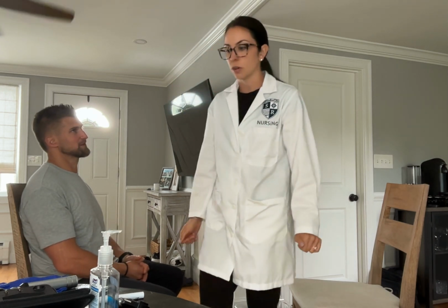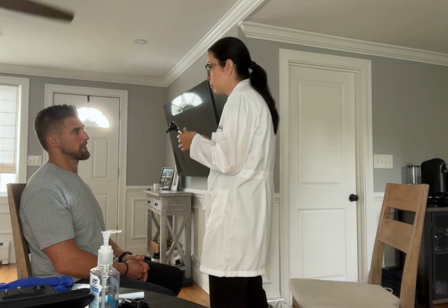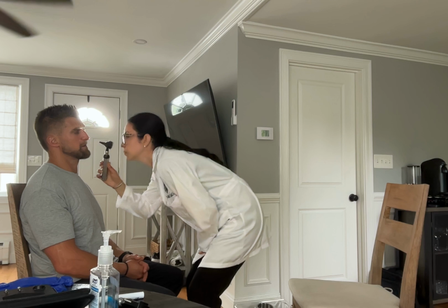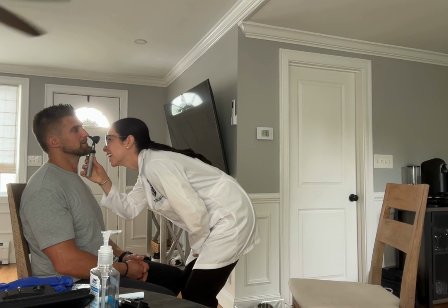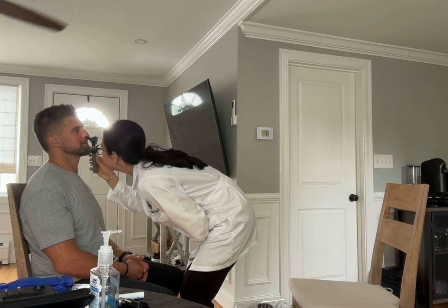Okay, then I'm going to use an otoscope and look in his nose. So I'm going to be looking for the mucosa, the septum, the turbinates. Check for any polyps or discharge. Ooh, okay. Okay, septum looks great. A little bit of discharge. Okay.